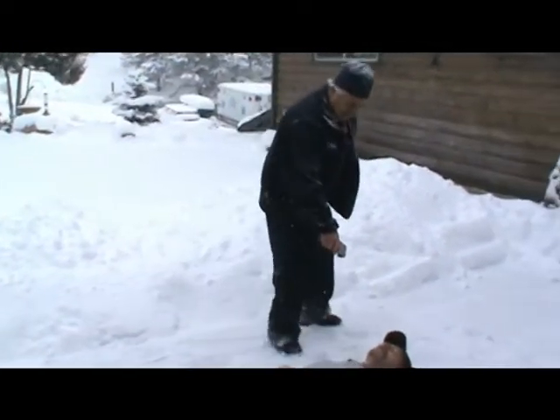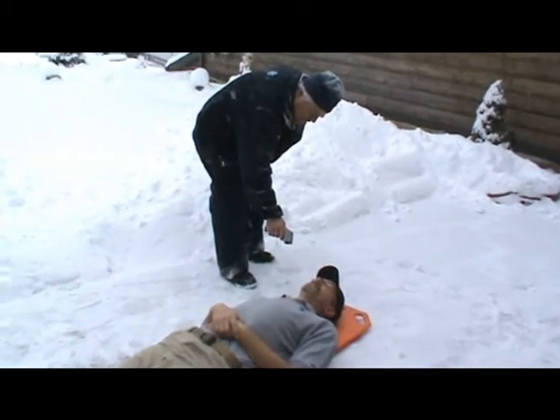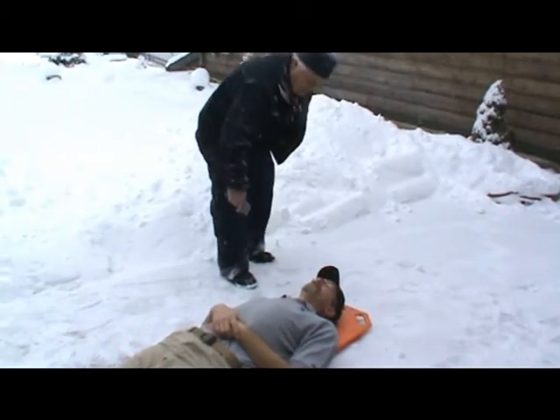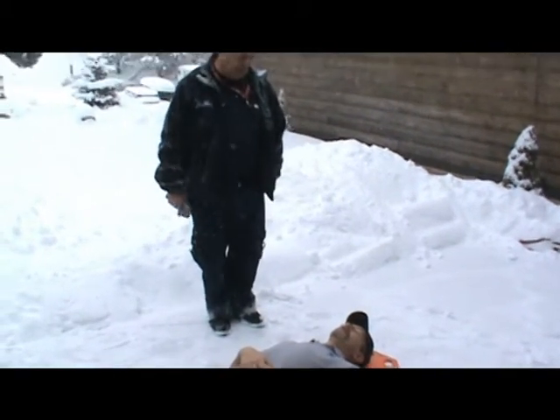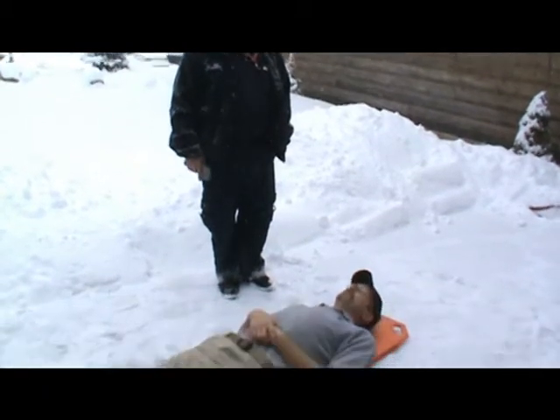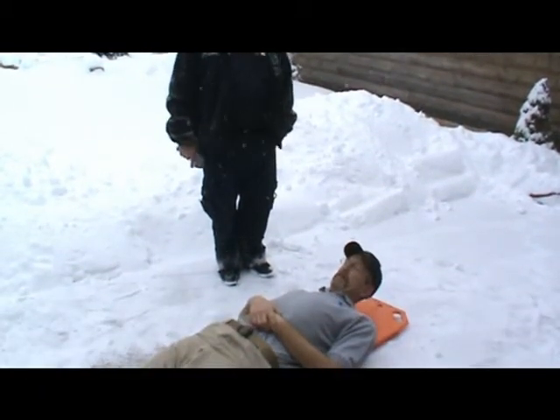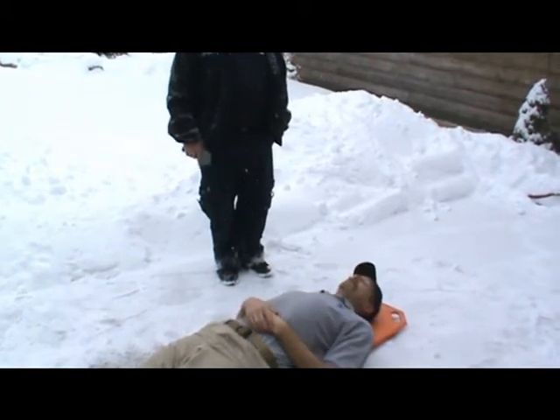If I take the temperature down here by where he's laying, well, I can't really get a good spot unless we take him off of there. But I assume you're not getting colder laying there, right? No, actually, that's the warmest part of me right now, what's in contact with the foam. So you're getting cold from laying in the snow and not being covered up. Being snowed on and the breeze coming over me. And of course, we would cover him up.